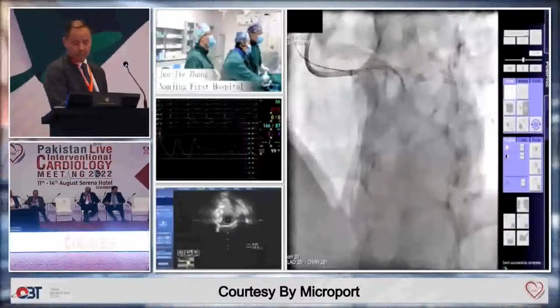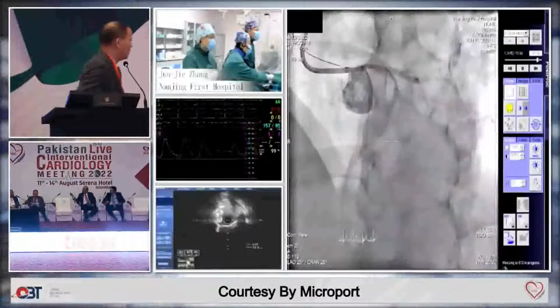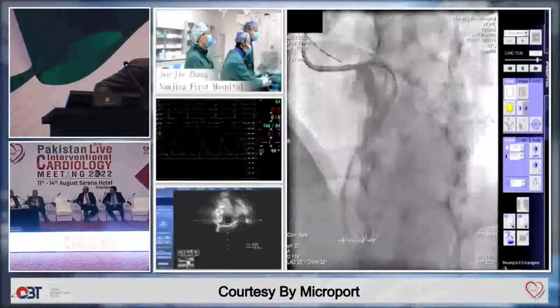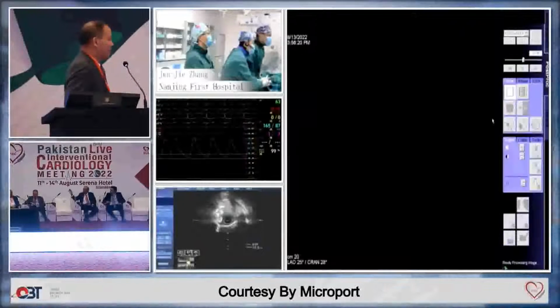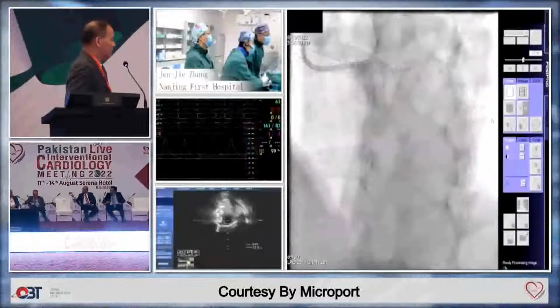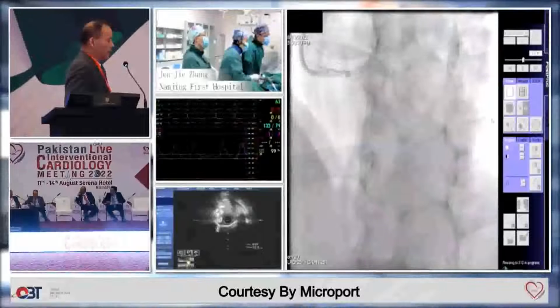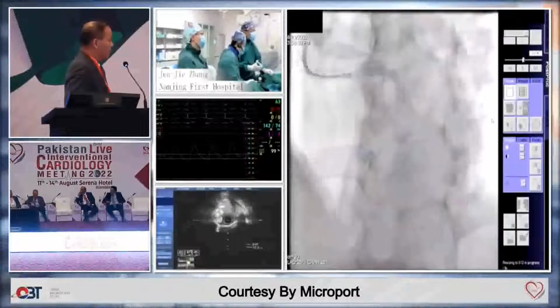Are you happy? Whenever we are doing this left main, up to the left main, there's always this big debate. Should you hang 1 millimeter out or should you not hang? That is the thing, because getting it right at the left main is always an ostial trick. So what is your take on it? Yeah, right. I think a maximum protrusion limited to 1 millimeter is a requirement.